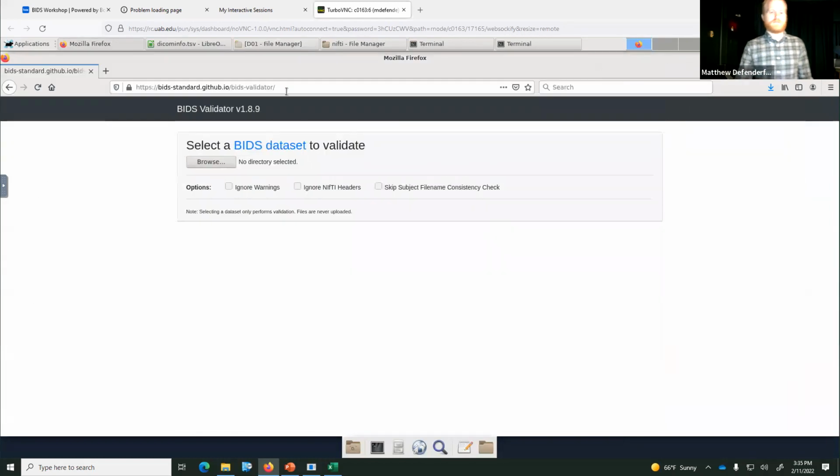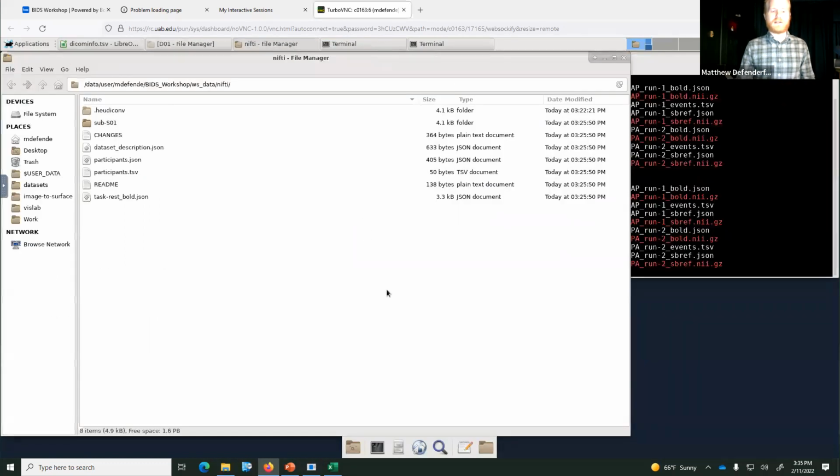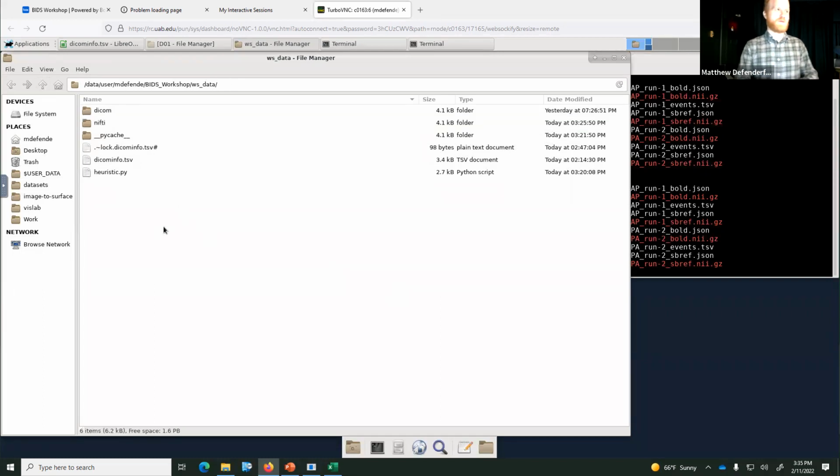So now, if we wanted to actually use this data set, and I'm just going to do this very quickly, I apologize for going over how long I thought it would take. The last thing that I wanted to talk about was fMRIPrep.